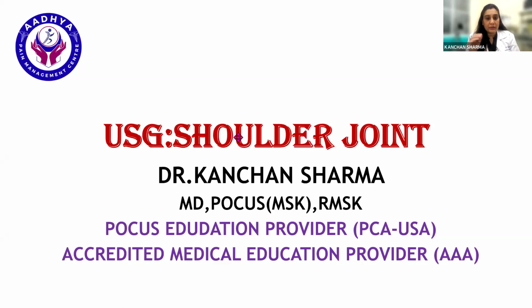Fine. And if you really want to excel in MSK, the foremost important thing is to be very good in your anatomy. So whatever I am going to teach you, listen to that very carefully so that it is getting registered in your brain and you're able to see what exactly you are supposed to see when I'm scanning, right?